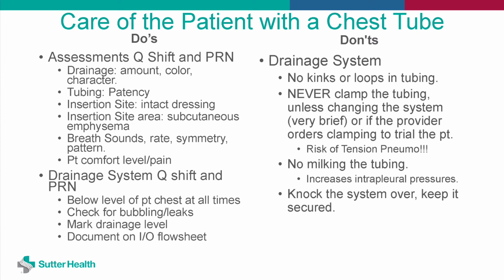Do not milk the tubing. This increases the intrapleural pressures. Do not knock the system over. Make sure you keep it secured.